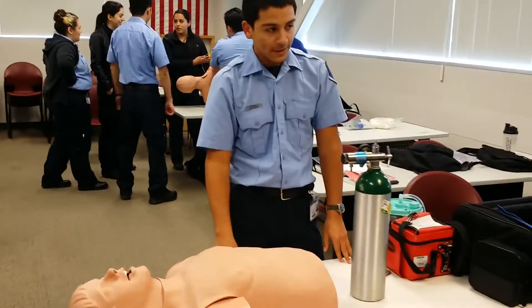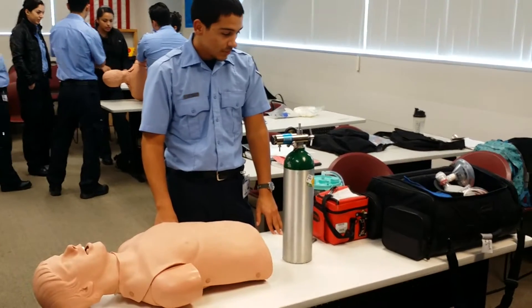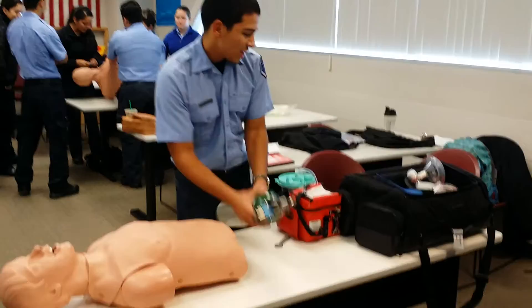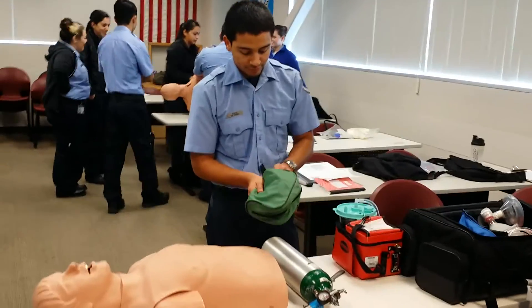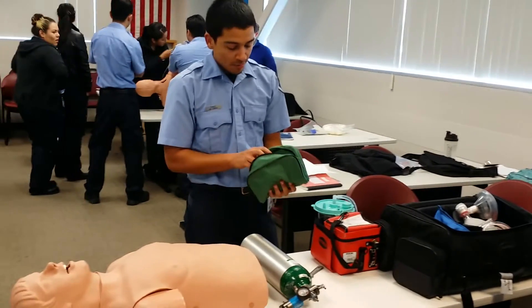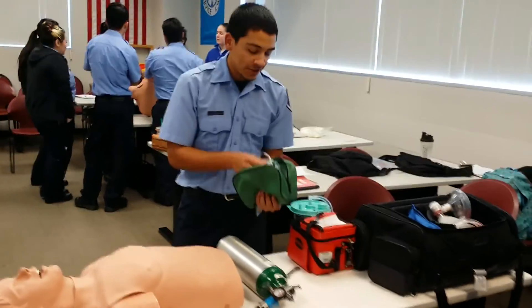We have a patient here. I'm going to start them off on the nasal cannula. I'm going to put them up to six liters per minute. So my nasal cannula is going to be for little sick patients — it's going to be two to six liters per minute.